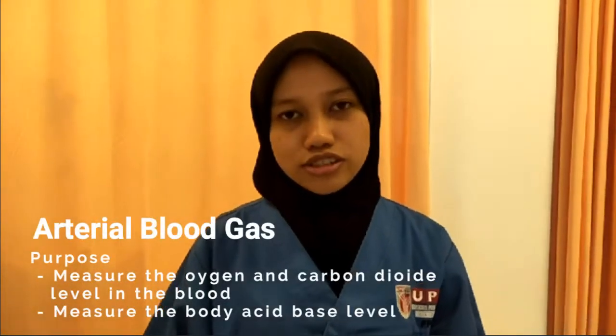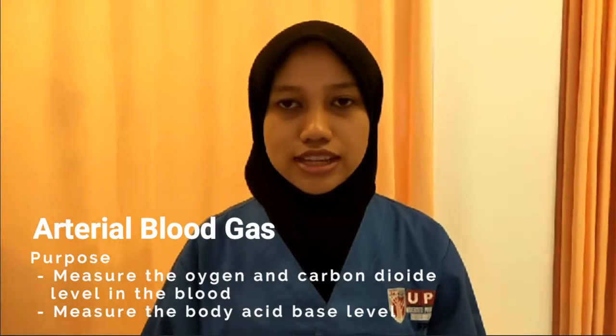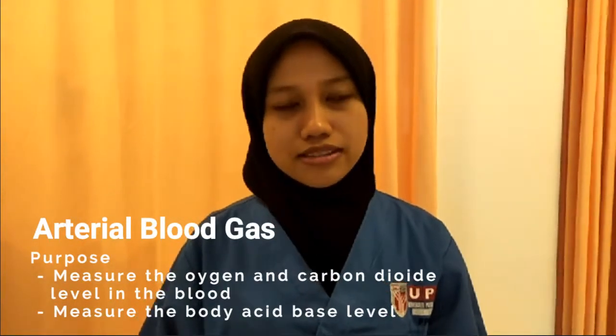So the purpose of arterial blood gas test is to measure the oxygen and carbon dioxide level in the blood. It also measures the body acid-base level, which is normally balanced when healthy. So Nadira will show us how to perform the ABG test procedure.